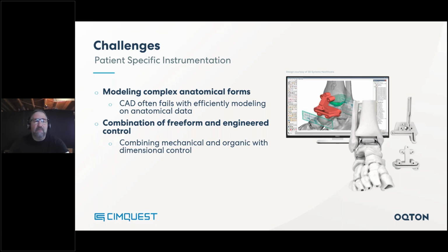Sometimes manufacturing processes have certain requirements. Freeform gives you the ability to have this type of control while still respecting and working with the anatomical data. There's an added element that for repeated workflows, Freeform does offer some additional control that is useful when it comes to regulatory compliance.